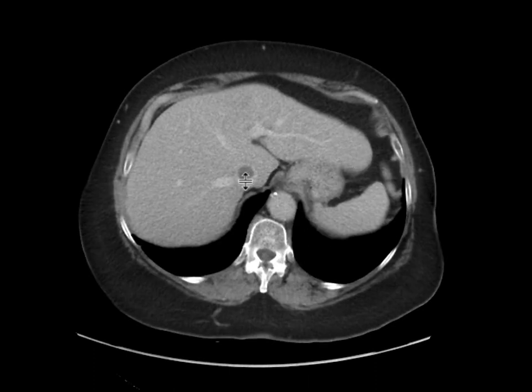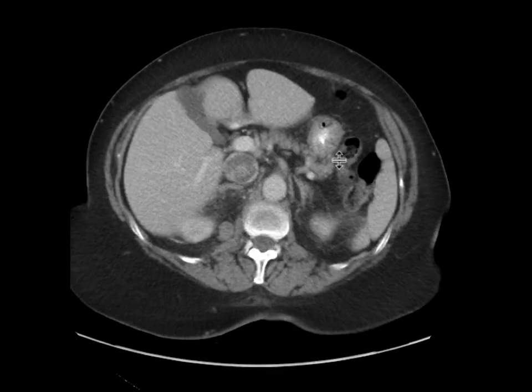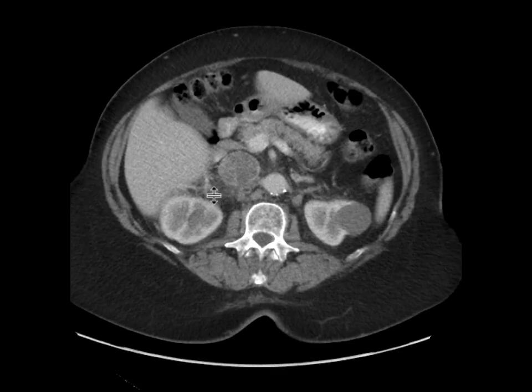Now some of that thrombus, for example in this location, is probably a bland thrombus, but a lot of that material, which is heterogeneously enhancing over here, is going to be tumor thrombus in this patient.